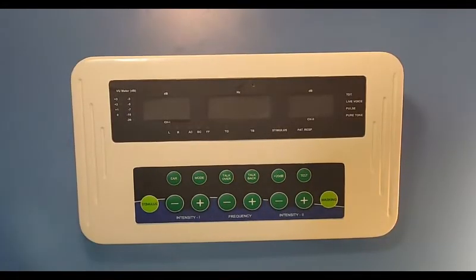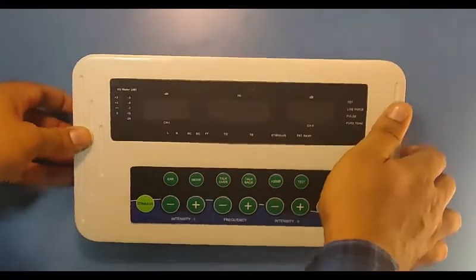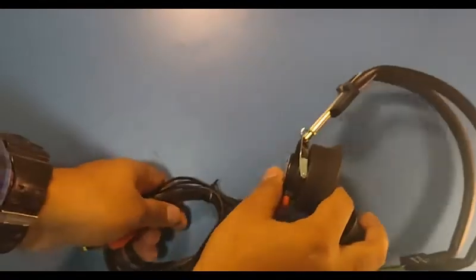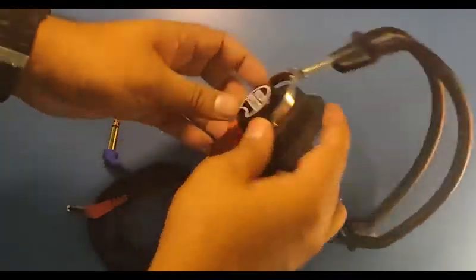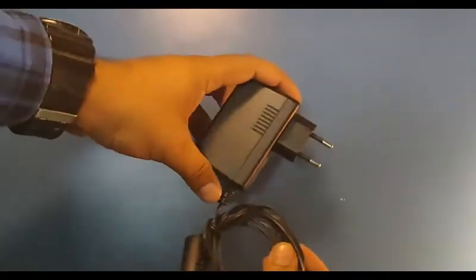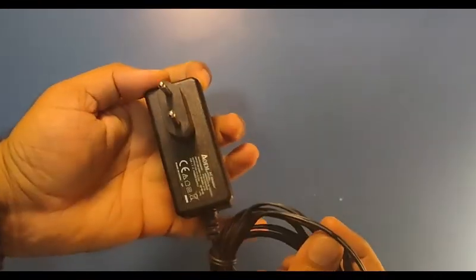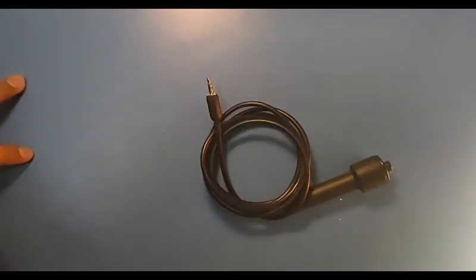Now let's talk about the standard accessories included with the Audio Mini. This is the main console. You will get Labad headphones as standard — these are the LT20 headphones. This is the power adapter included with the Audio Mini. This is the bone vibrator — an Oticon bone vibrator. And this is the patient response switch, which you will get as a standard accessory.